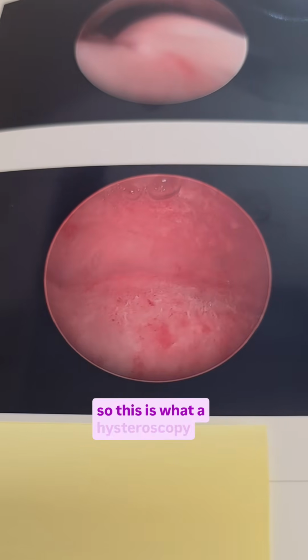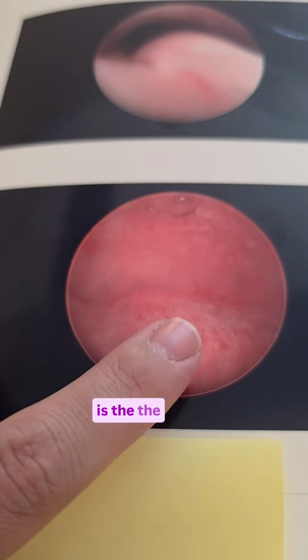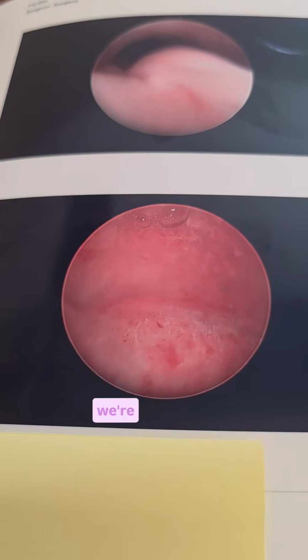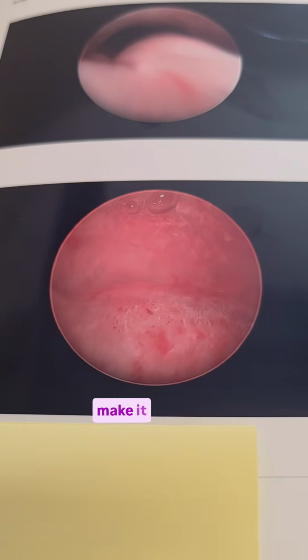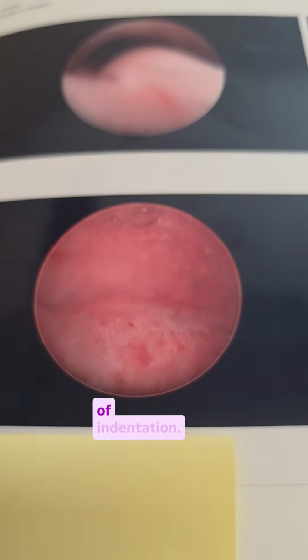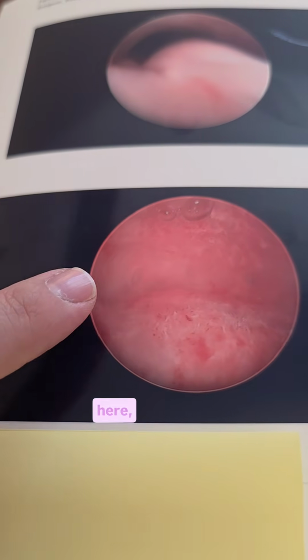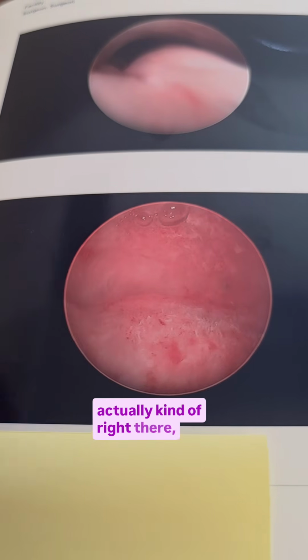Okay, so this is what a hysteroscopy looks like. And we can see here, this is the back wall of the uterus, and this is the front wall of the uterus. This is an air bubble because we're actually putting liquid into the uterus to basically make it stay open. And we see over here, this is what we call tubal ostia, this little kind of indentation. That's where the left fallopian tube is actually coming into the uterus. And then over here, the right tubal ostia is actually kind of right there.